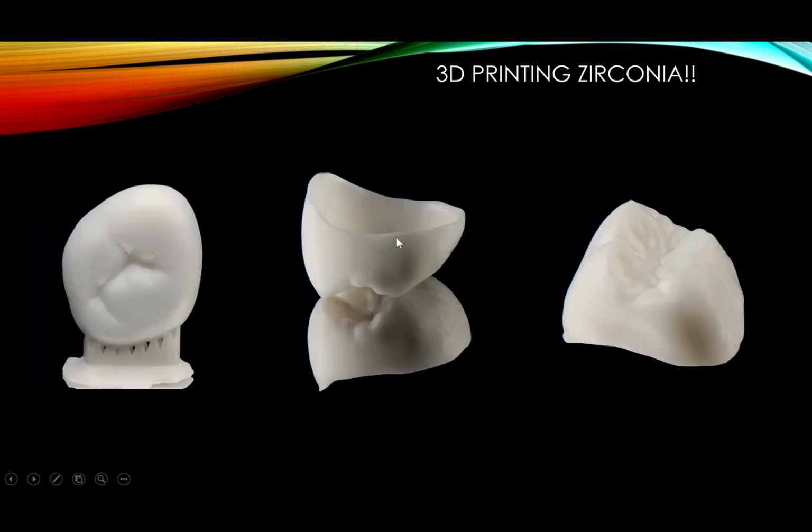Now this is how they look. I don't know what machine this was produced from, or what machine produces this. There are many machines in the market now, cheaper than the Lithoz, of course, and this is the way they print zirconia.